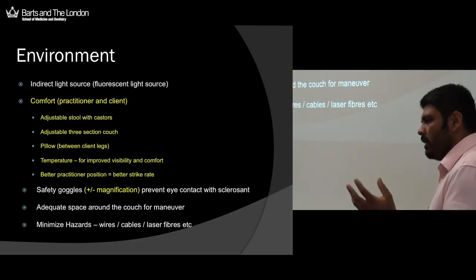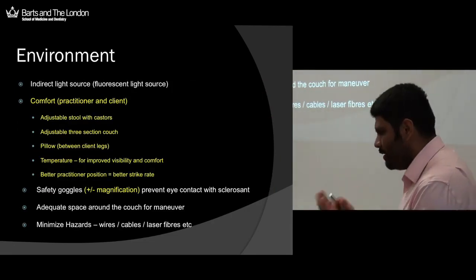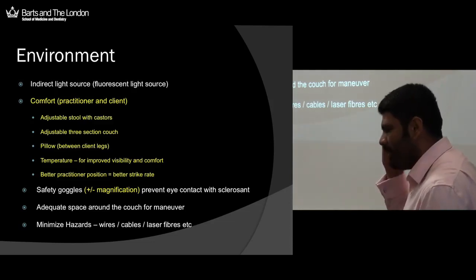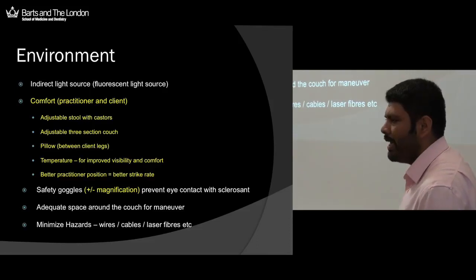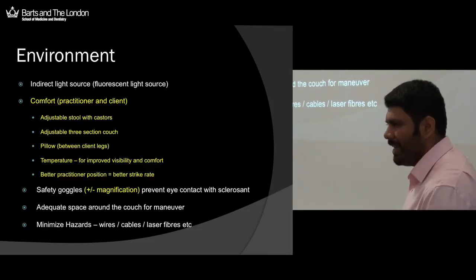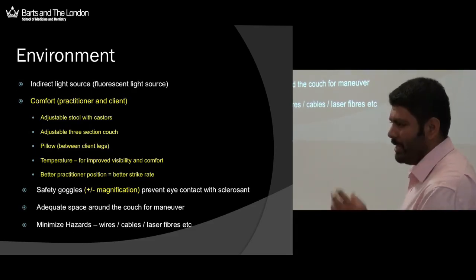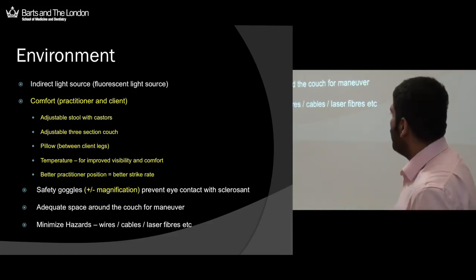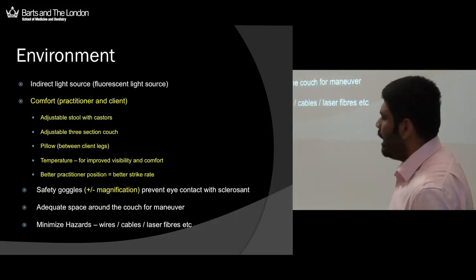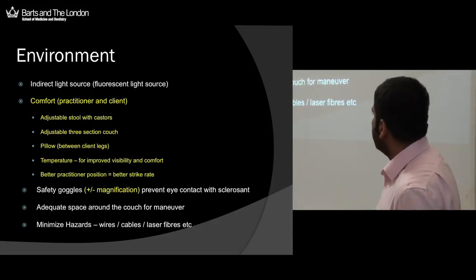Environment, well, light sources. Very often people will use assistance and various light sources. Now, with sclerotherapy, you need to see a good contrast. So using very, very bright light sources or taking photos with flashes, you often just white out the detail. These days we can actually get cross-polarized light sources that will help us do some subsurface viewing and see telangiectasia and webs more easily under the skin. They are useful tools in helping to inject smaller and finer vessels.